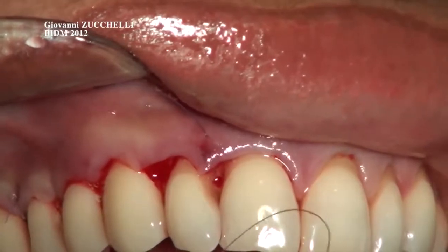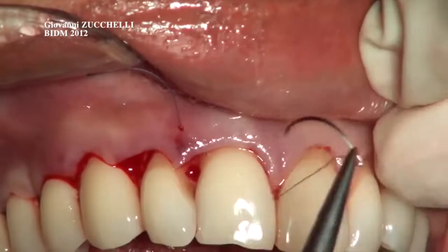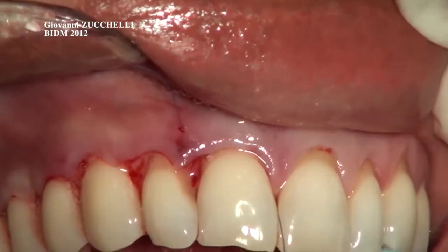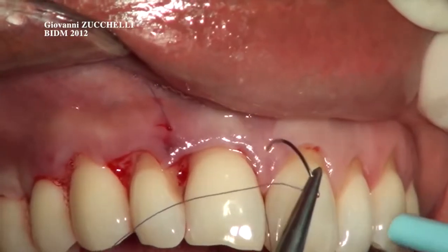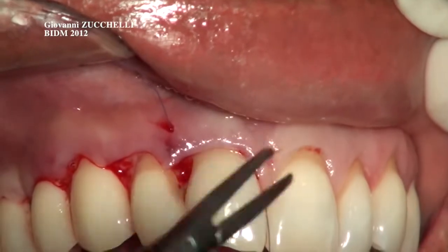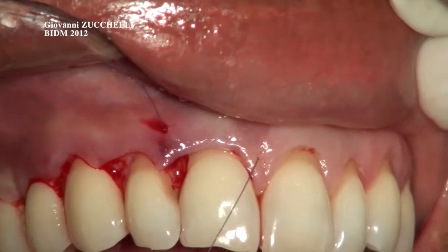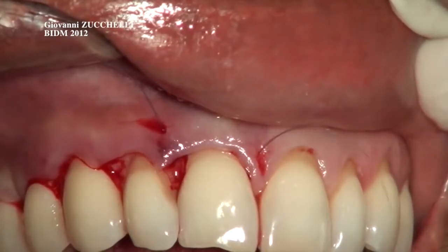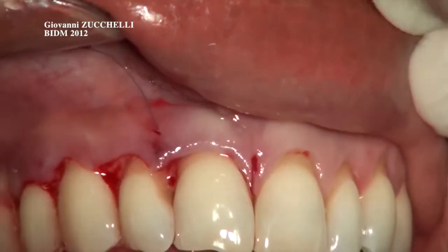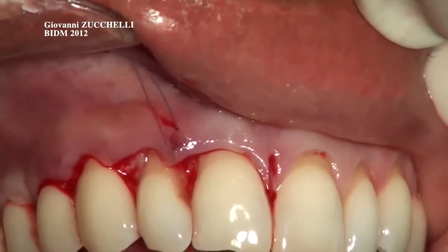Again, below the contact point between the two central incisors, you anchor to the interincisor papilla that has not been absolutely elevated, so it's an important anchorage in the coronal direction. Again, below the contact point between the central and the lateral incisors without perforating.